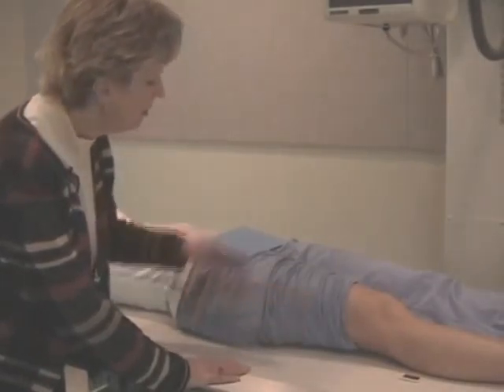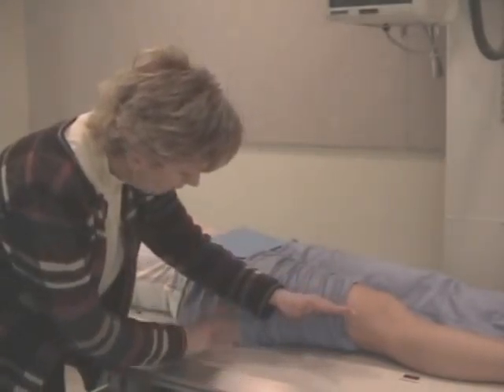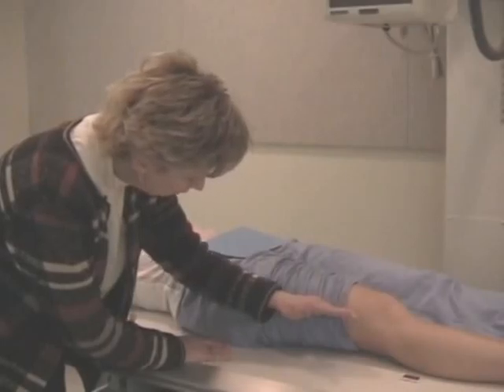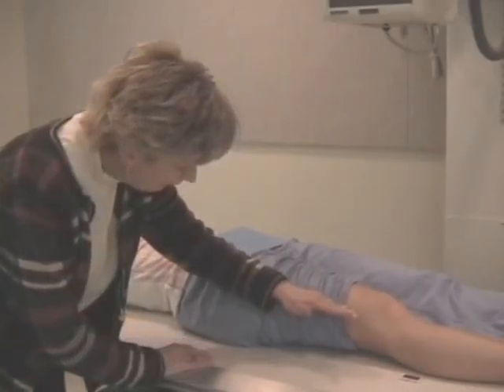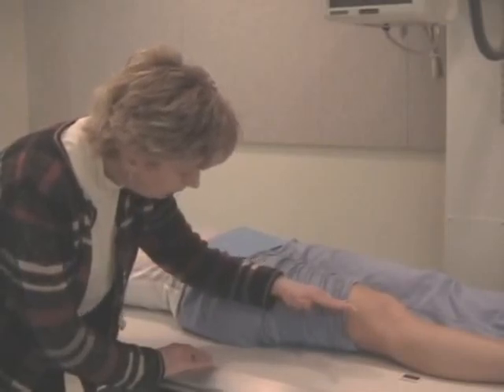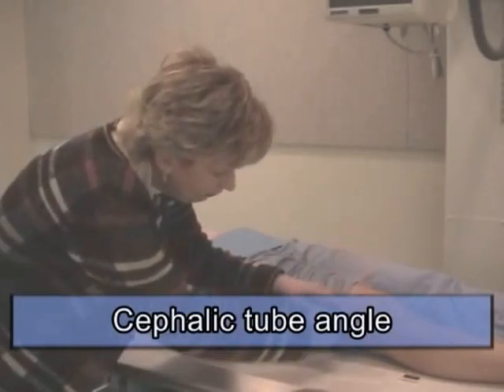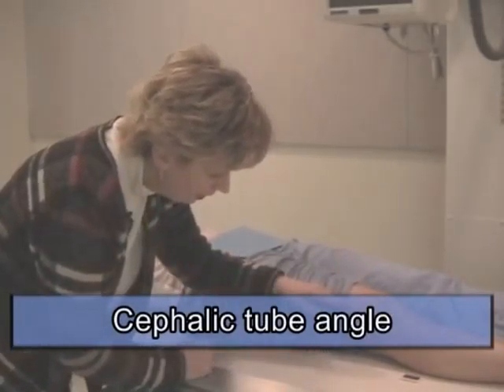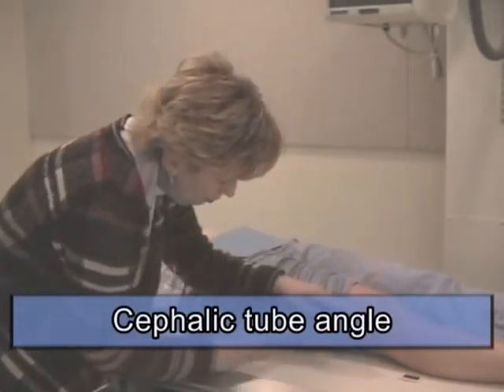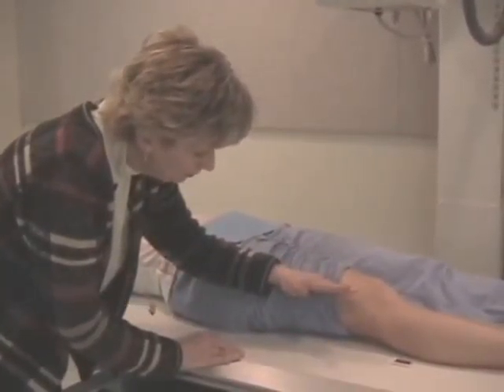If Kristen was heavier, picture adipose tissue here building the femur up, and the femur would be at an angle like this. If the femur's at an angle coming up, you should have a 5 to 7 degree cephalic tube angle. Again, a cephalic tube angle, because you want to come in perpendicular to that joint space.